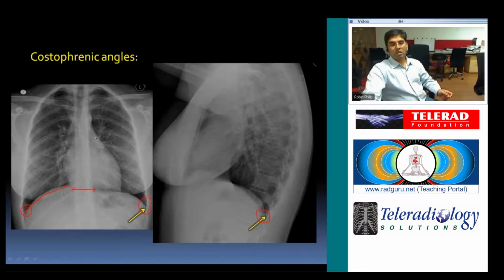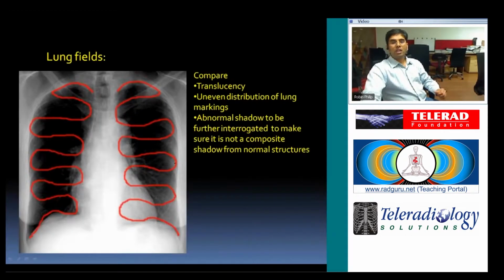And then the left diaphragm, in the majority of cases, is lower because the heart is sitting on that. Contrary to the notion that the liver, located in the right upper quadrant, pushes the right hemidiaphragm, that's not true. It's mainly because of the heart sitting and depressing the central portion of the diaphragm, central and left portion.